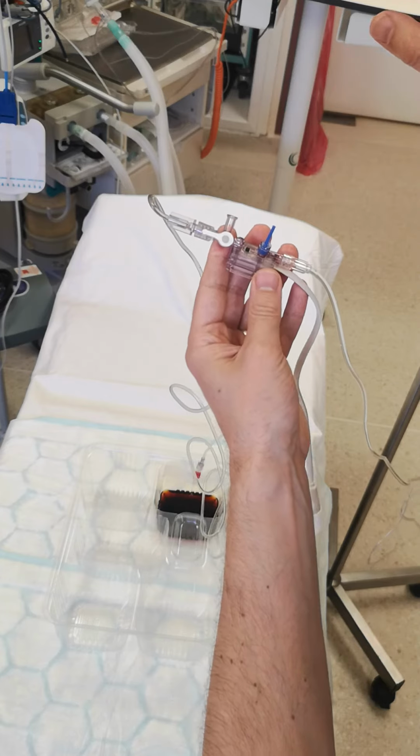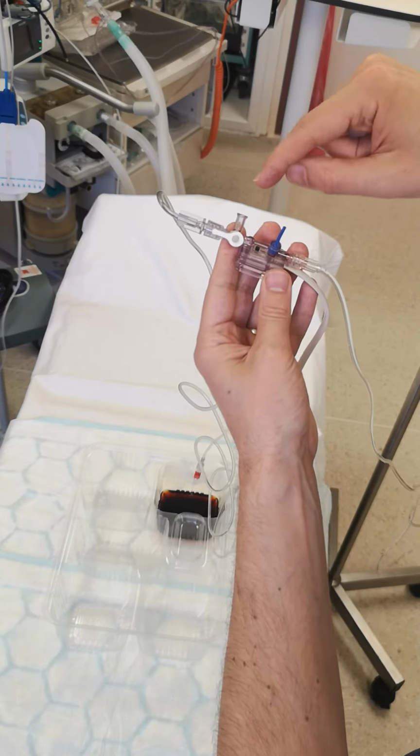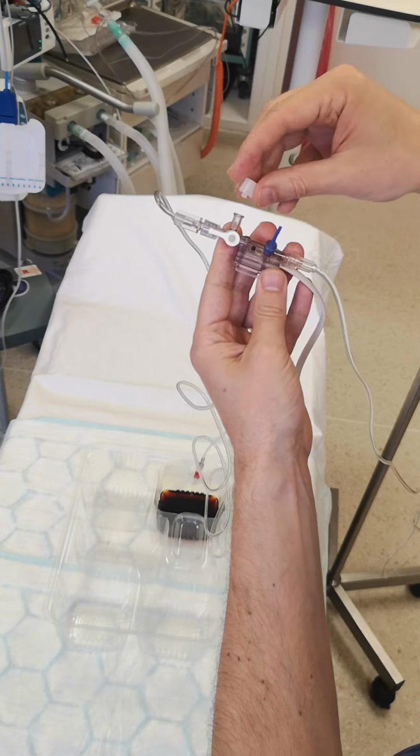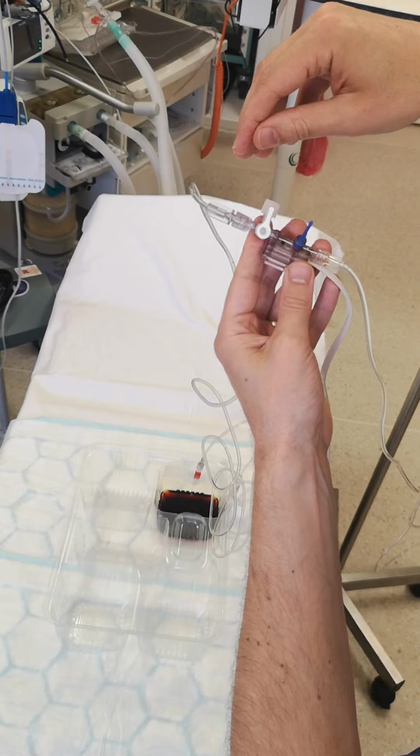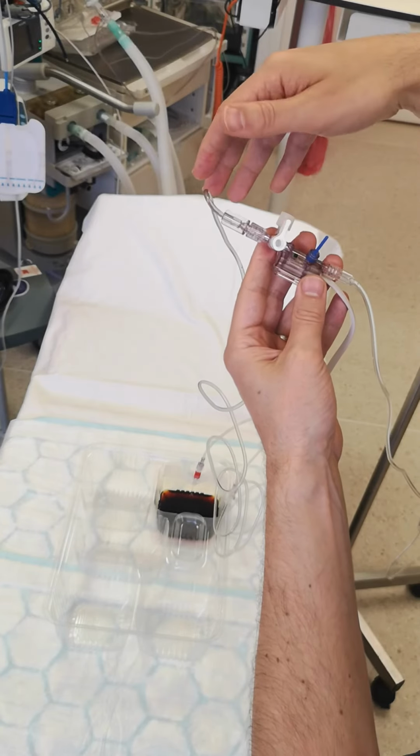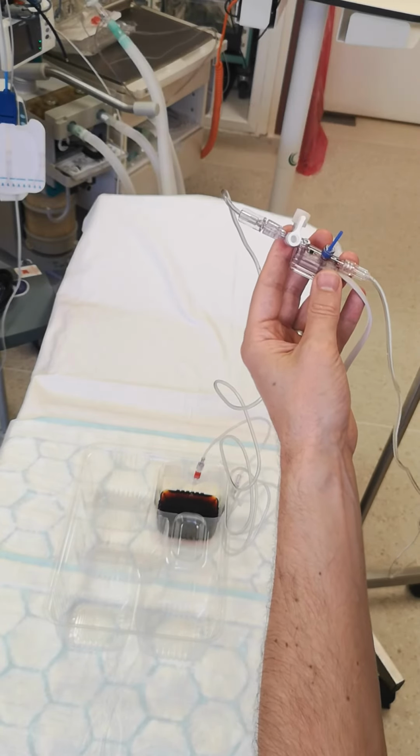So now when we press zero on the monitor, it will measure the pressure in the air here. Wait for it to beep, and then we can replace that and usually turn that back open to the patient. And then, if everything is connected correctly, you'll then see the waveform come up on the monitor.